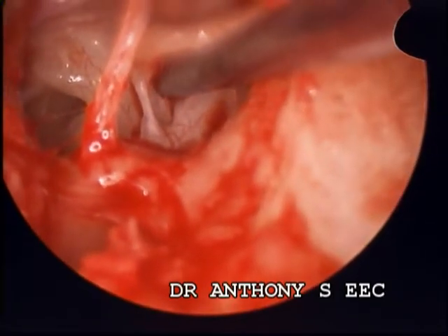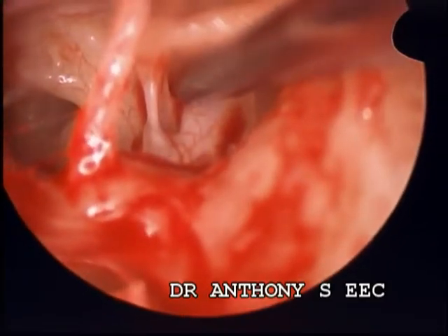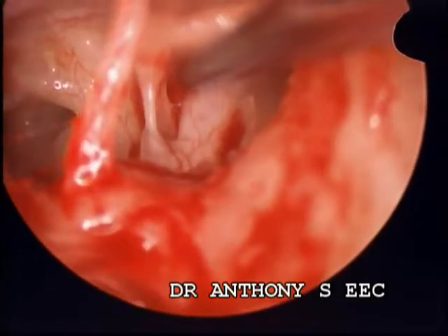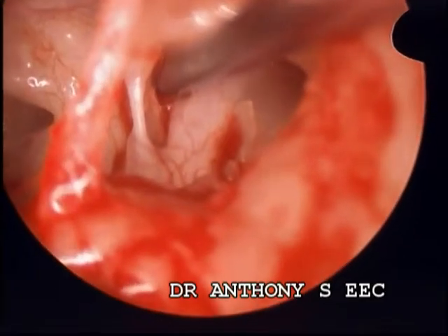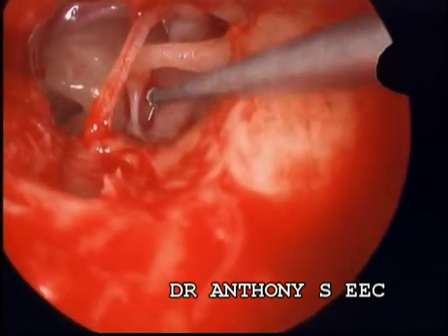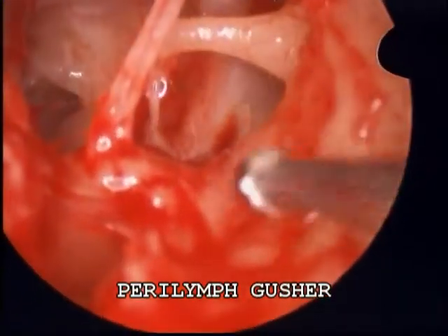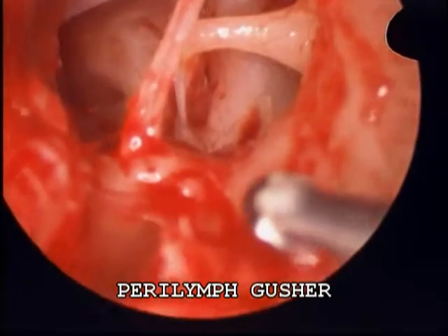The hole was made with a perforator on the footplate. That showed a minimal leakage of very little fluid, which was not very alarming. So the hole was widened by hand, and then we saw the unexpected perilymph gusher.